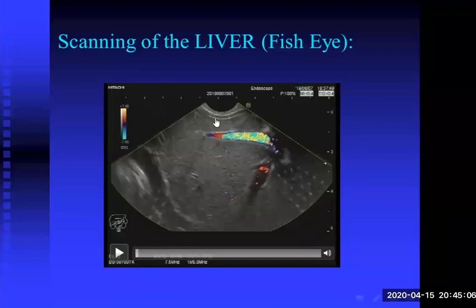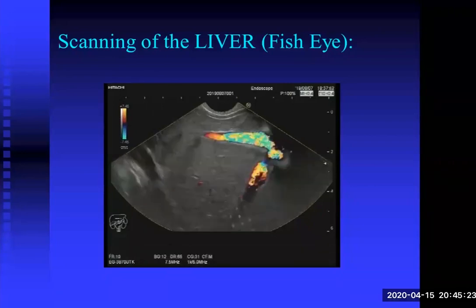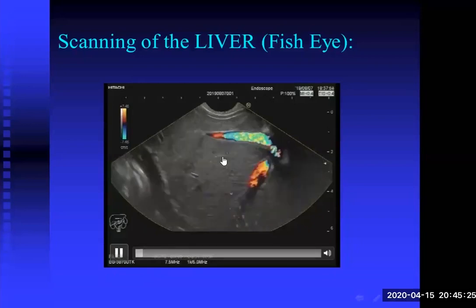And what is this segment in between the echo endoscope and the inferior vena cava? Yes, this is the caudate lobe, segment 1, right. And this segment is 8, and this segment is 7. 1, 8, 7. Let us continue. Yes, 1, 8, 7. IVC, right hepatic vein.